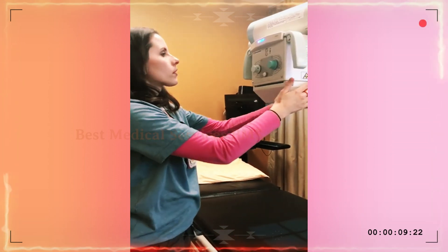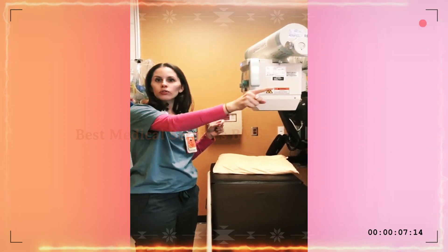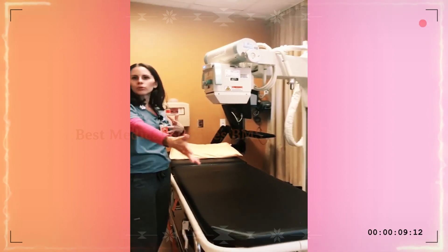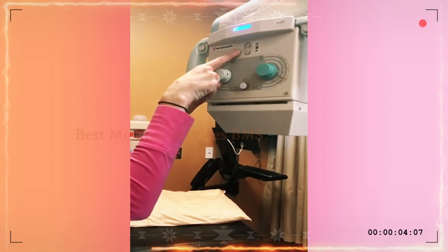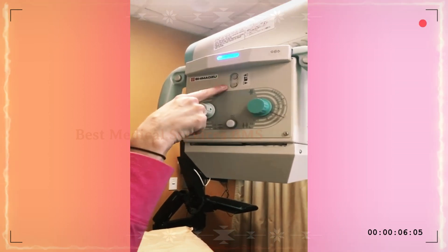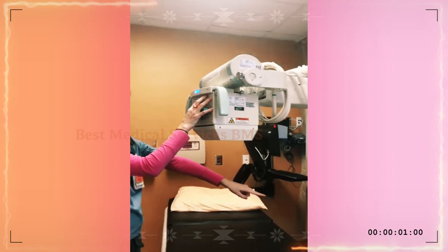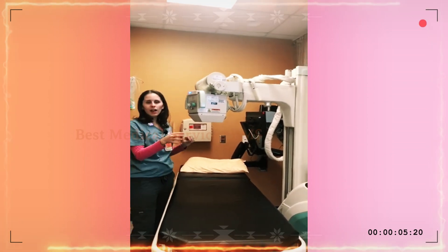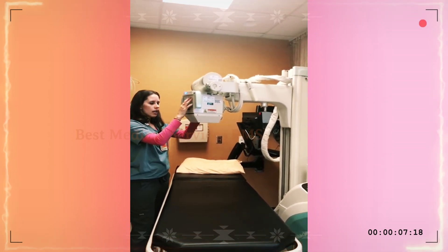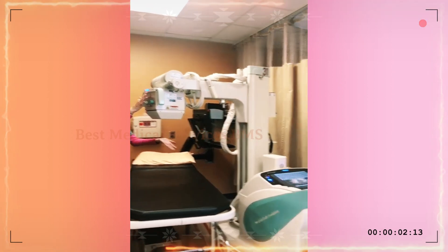If you are in a tight space and you just need a couple more inches but can't get over there — maybe there are people in the room or something happening — you actually have drives on the machine itself. There are these two top buttons: if you hit them, you can drive the portable forwards incrementally. It's very small and very slow, so you're not going to take anybody out or hit anything too hard. You can also drive it backwards — I'm not even pushing, it's doing it itself.